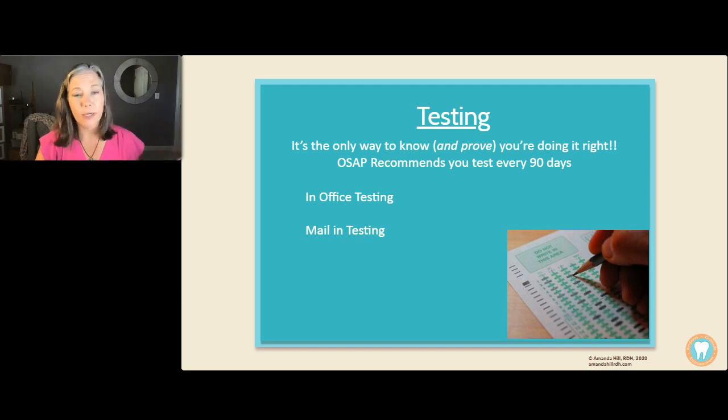So, oh my gosh, if you're convinced coconut oil is going to work, I don't think it's going to work. But if you're convinced coconut oil is going to work, test and see whether it does the job. So I'm not suggesting using coconut oil, by the way. But you really want to test every 90 days once you're on a good system. So my operatory in my dental office that failed recently, I'm actually shocking. I'll test again in a month, and we need to pass for 2 consecutive months, and then we'll move back to a 3-month program. And the reason is that once you've failed, you know that the biofilm is there. And like we talked about, that party that went from a biofilm party to a biofilm rave happens really fast.